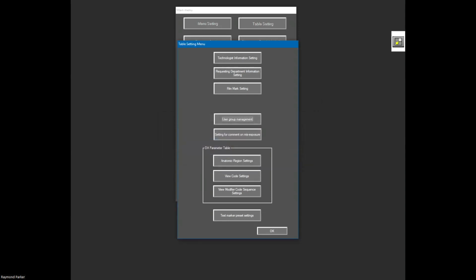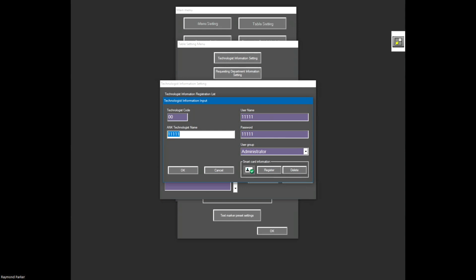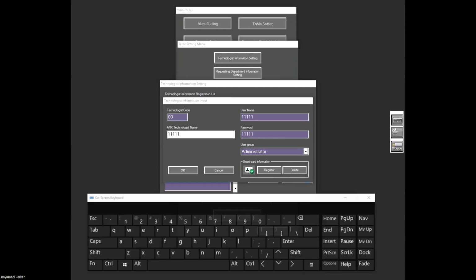Click OK once more. And to enter your information, you'll see that the image that comes installed will usually have this look to it. My first step is to delete these first or bottom 3 or 4, and then start with this top one. I then edit it, and I put in my first entry.